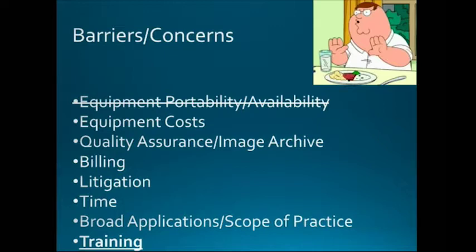And there are some interest groups, and there are some research networks that are getting formulated in primary care to explore whether people who are also learning ultrasound can QA each other's images in a Wikipedia-type fashion, where we police ourselves. But I think you also mean getting into the EMR as well.